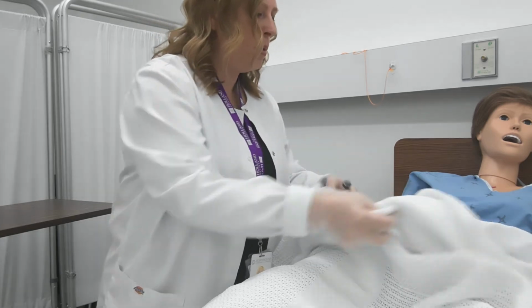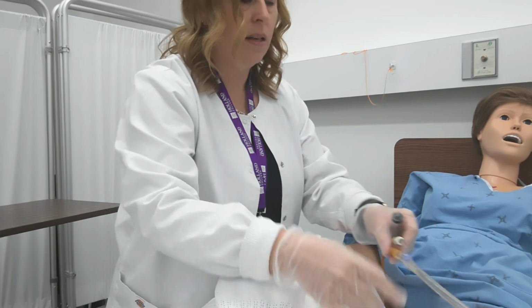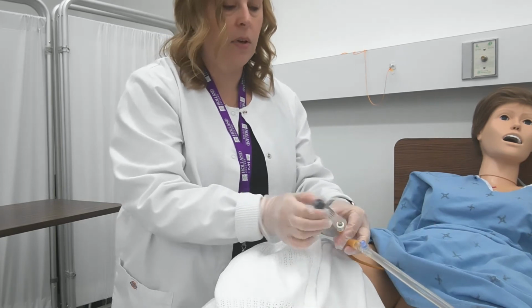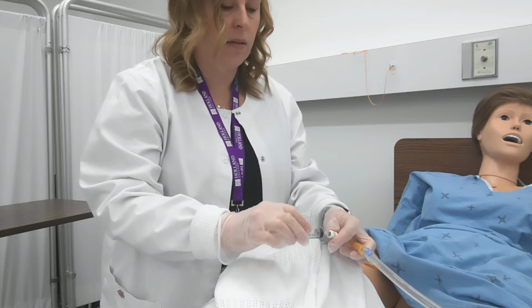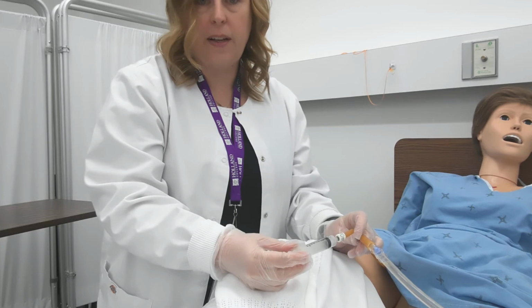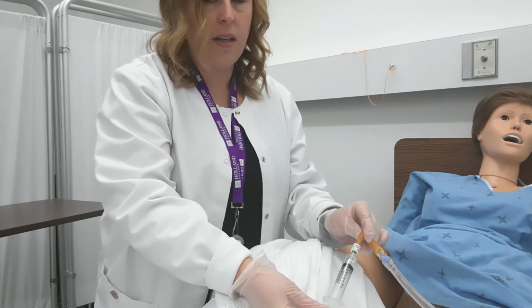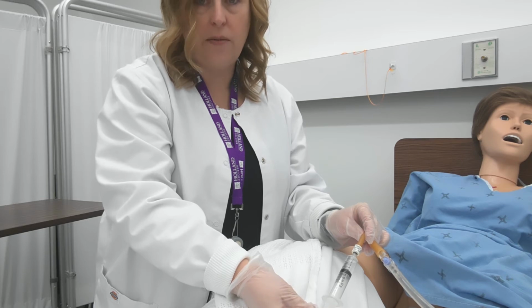I'm going to expose the catheter, and I'm going to remove the securement device. Then basically all I'm going to do is take my syringe and put it in the port, the same port that you use to inflate the bulb. As you can see, the fluid is starting to go back into my syringe and deflate the bulb.